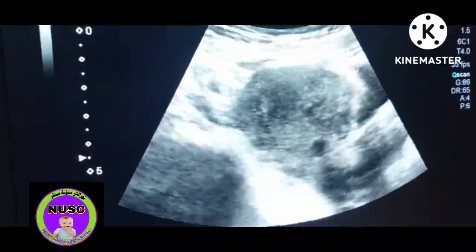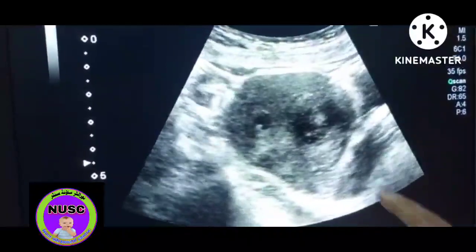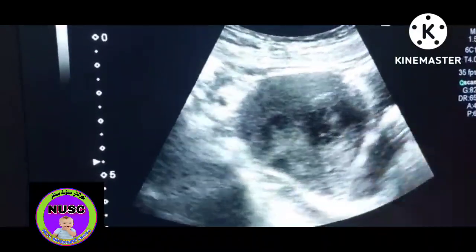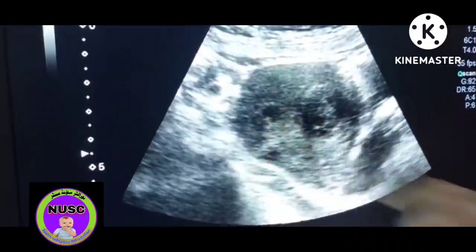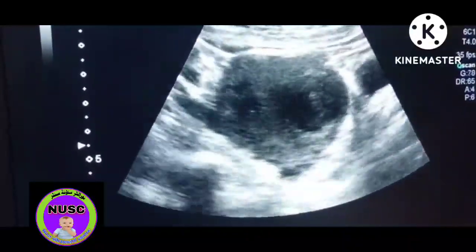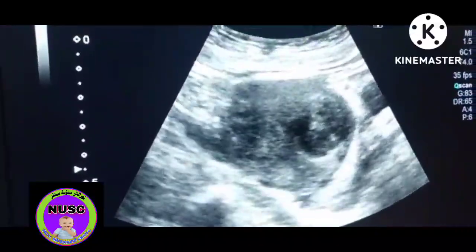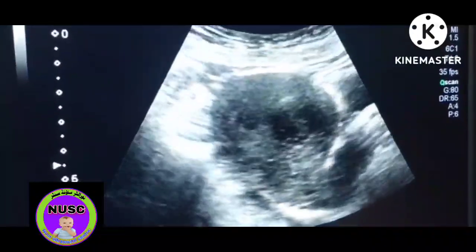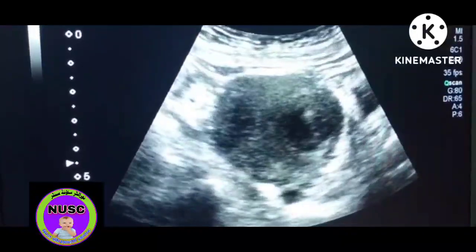One thing I want to share — note here, this is a black and round thing in the anterior wall of the uterus. These are all its features. The two things which we should remember: black and round, that is well-demarcated and hypoechoic.